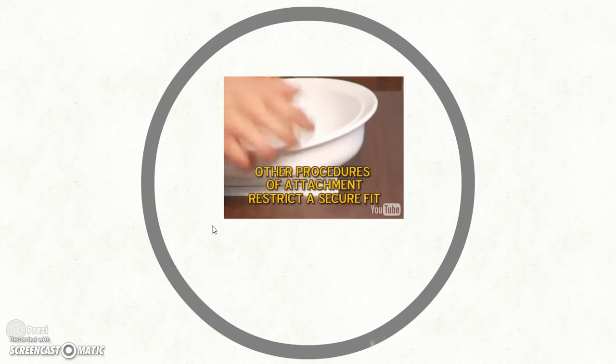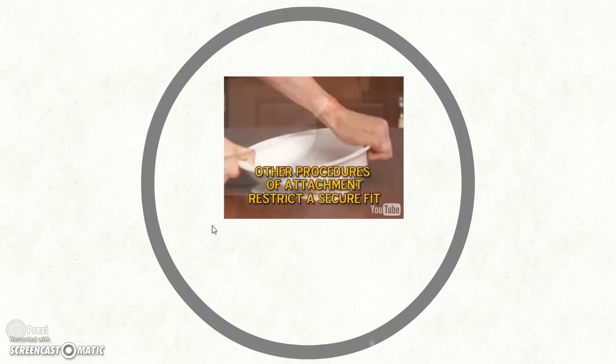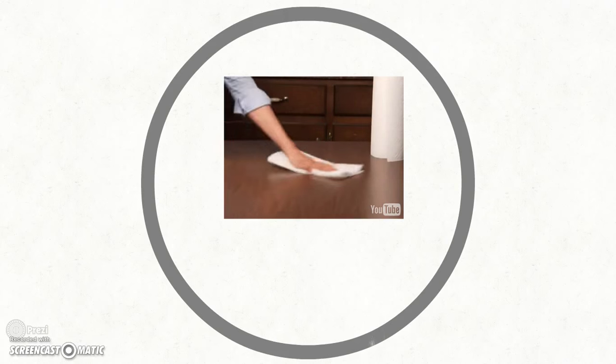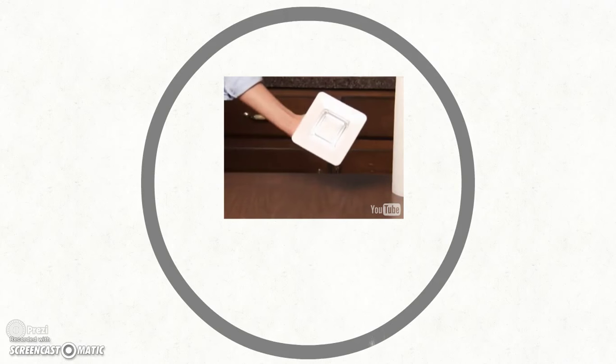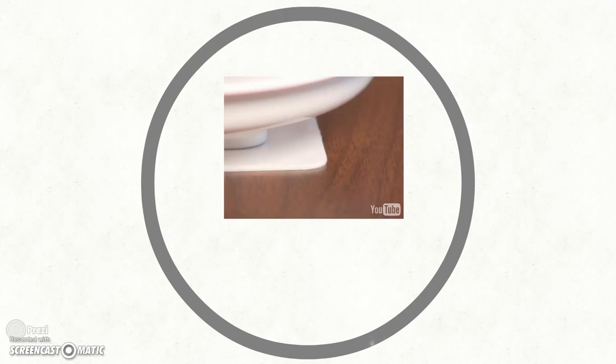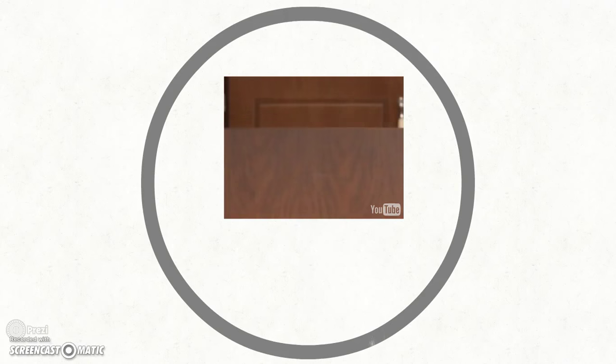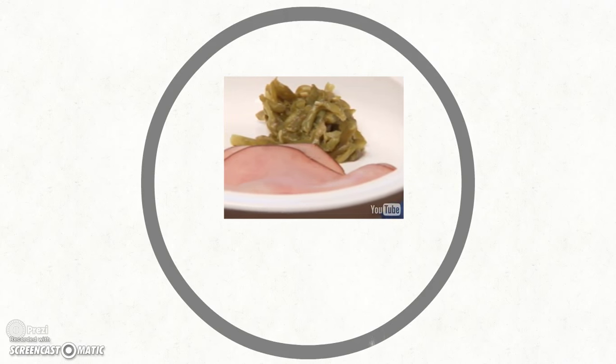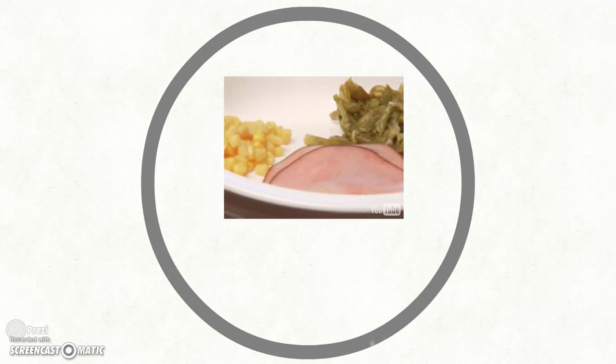With its patented suction hold system, Freedom Dinnerware will not move. You can push or pull and the suction will hold until you lift the bottom corner of the pad. It's vital to clean the pad and tabletop with water or window cleaner for maximum suction. To remove the scoop plate, simply grip the corner of the pad and pull upward until it's fully removed from the surface. It's important to place all food on the dinnerware after heating for safety reasons, as hot plates increase the danger of burns when eating independently.